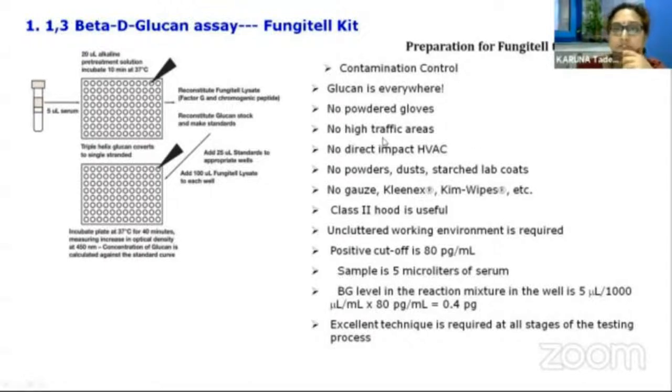So no powdered gloves, no high traffic areas, no direct impact of HVAC, no powders, dust, or starched lab coats, and no gauze. You have to use special wipes. And a class 2 hood is very important. An uncluttered working environment is required. The positive cutoff is 80 picogram per ml.